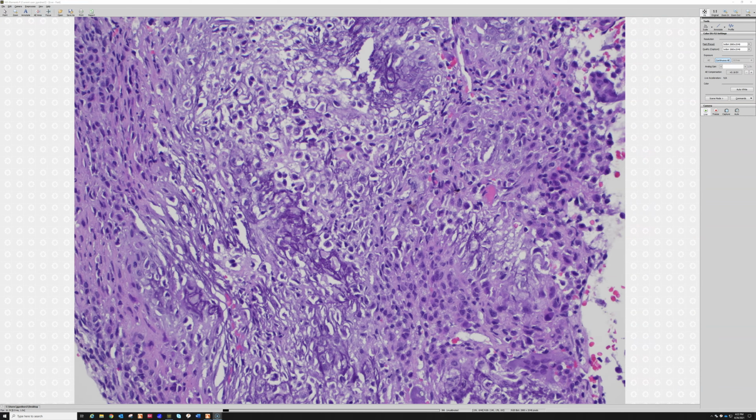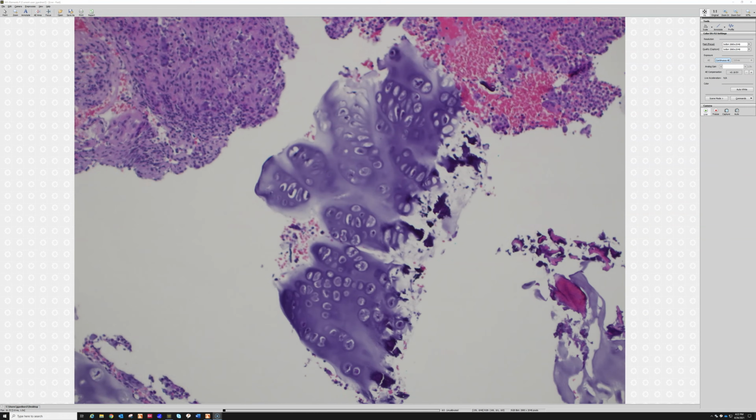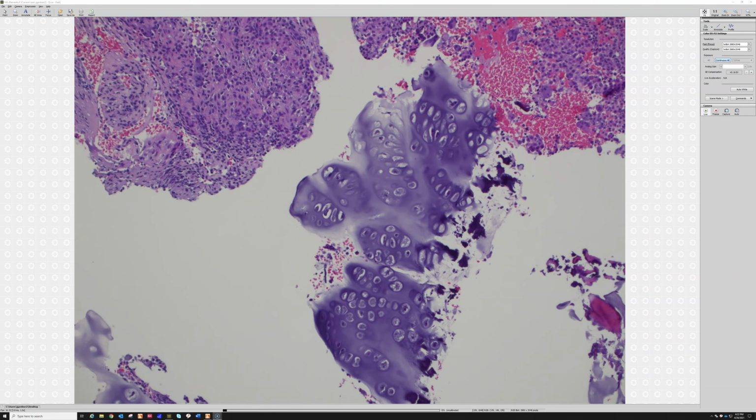So these tumors here, this is chondroblastoma, which is a benign tumor of cartilage. And here what happens is the chondroblasts don't develop into well-formed mature cartilage like the cartilage we saw over here, the mature background normal cartilage, like from the growth plate here. You can see the chondroid cells are arranged into these rows, these tall columns, which is typical of what happens at the growth plate. So that's the background normal cartilage for comparison.